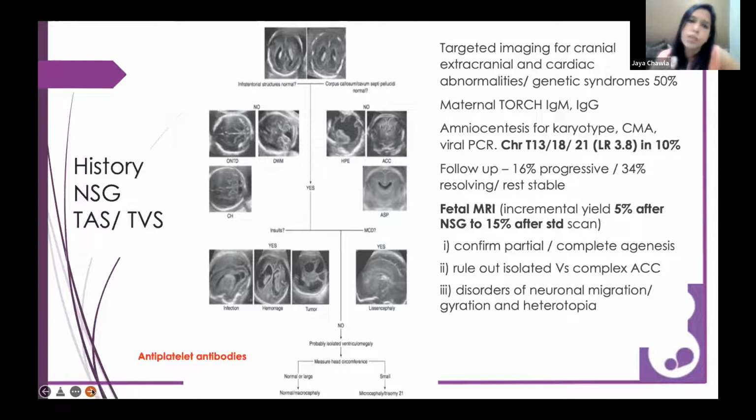So if we have periventricular calcifications and we look at synechiae, then we're probably looking at an infective pathology. And therefore, definitely, even otherwise, the component of serology, maternal infection serology in terms of TORCH, IgG, and IgM would be required in these cases. And if we have a baseline serology, prenatal testing, or maybe first trimester testing, that is going to be a great help in that particular regard.